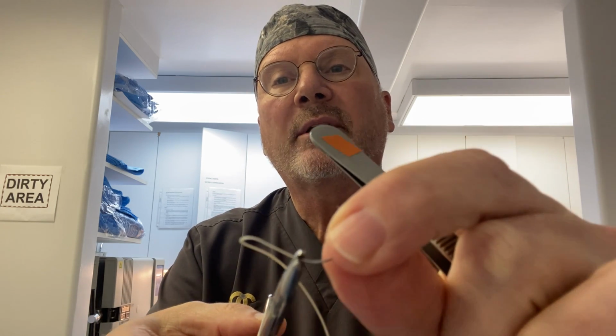And when you're grasping a needle, it's faster to grasp if you have that little tying platform there. And the proper position for holding a needle in your needle holder is with one third of the needle behind you and two thirds in front. And you try to avoid grasping it right on what's called the swage. It's where it goes from metal to the thread.